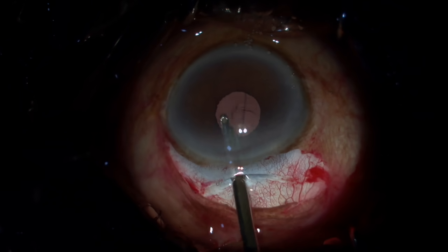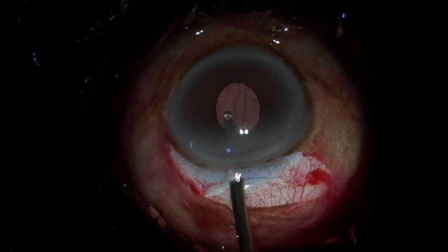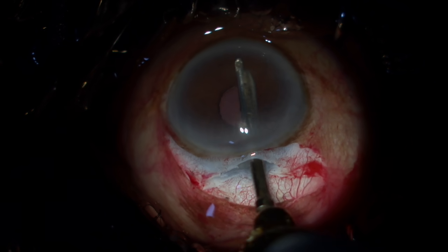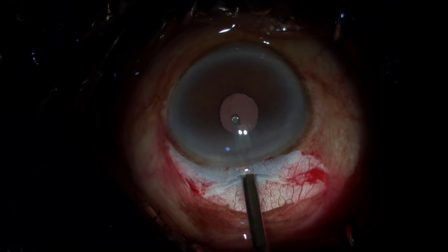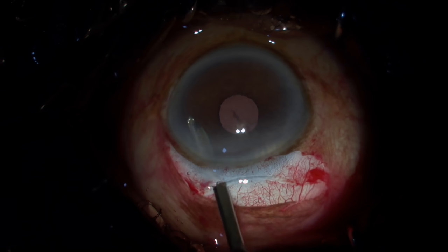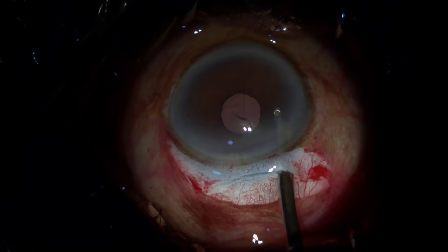The visco should be completely washed from the anterior chamber. Go near the angles as well so that all the visco stuck to the angles can be washed. I also do a small flush on the endothelium because the visco stuck on the endothelium can also be washed this way.